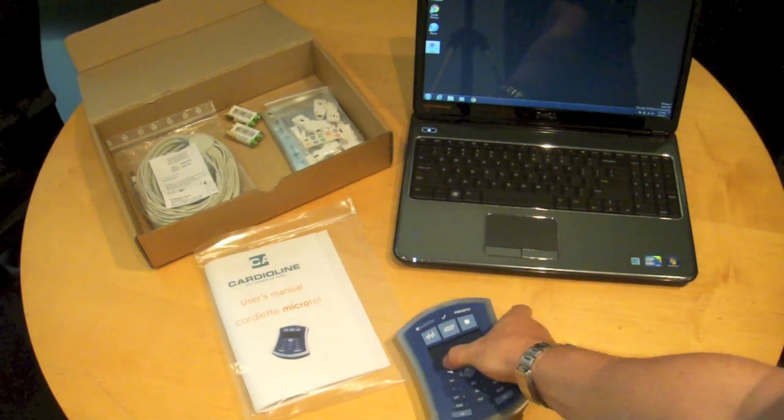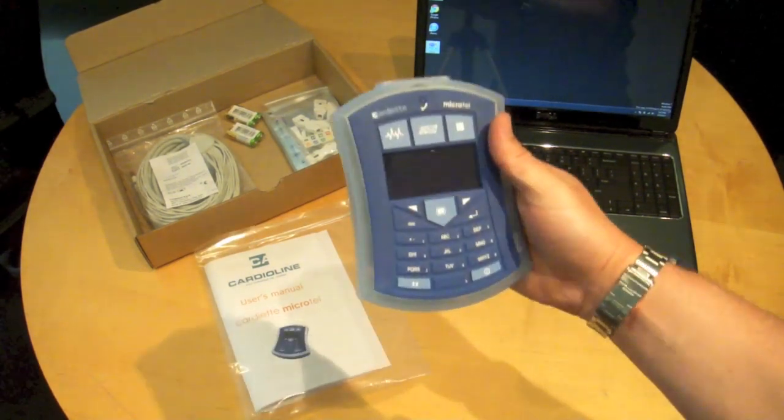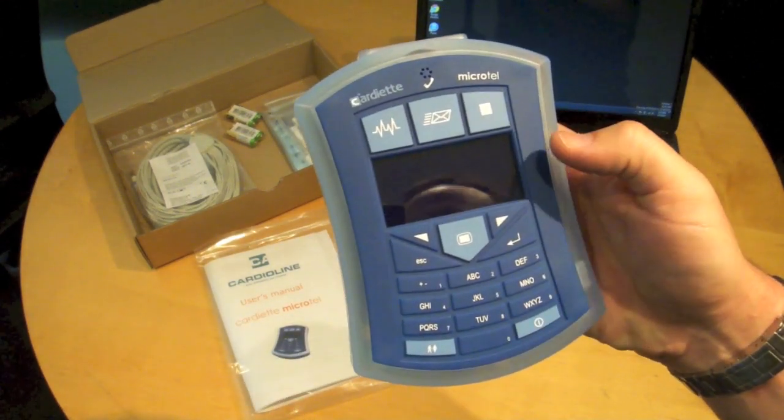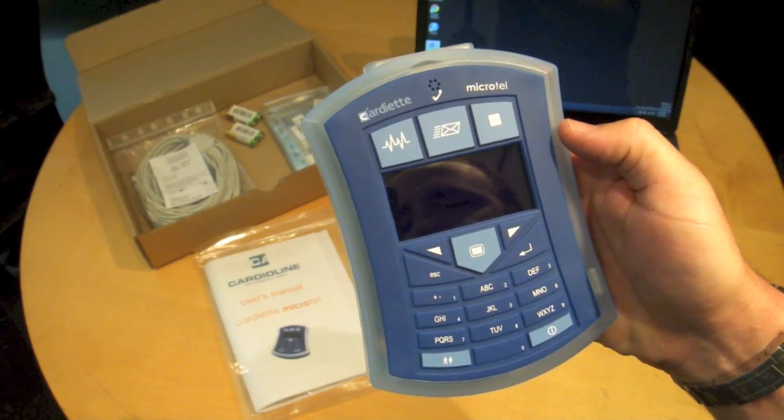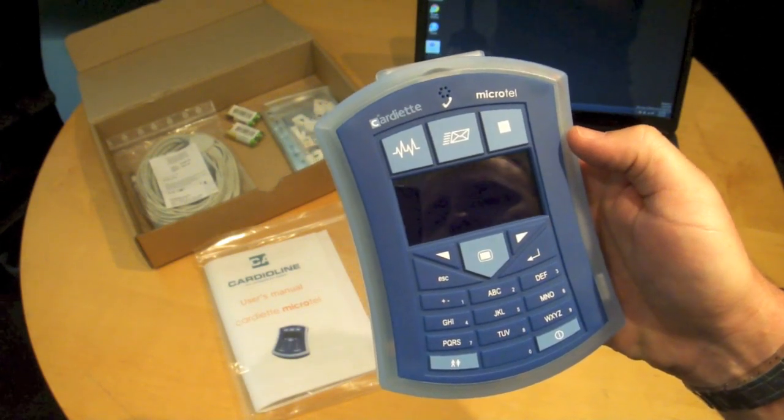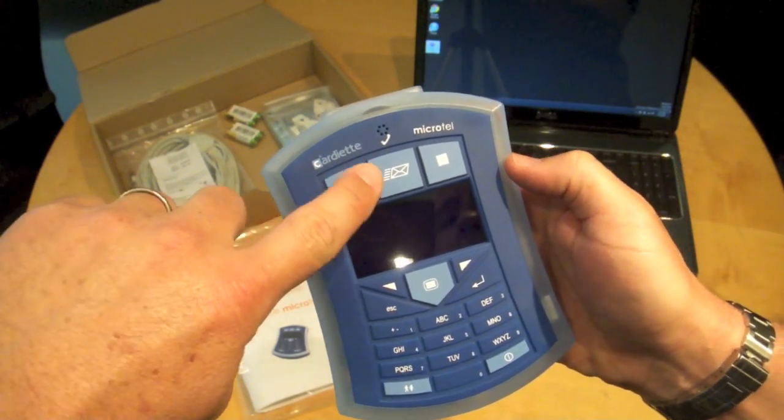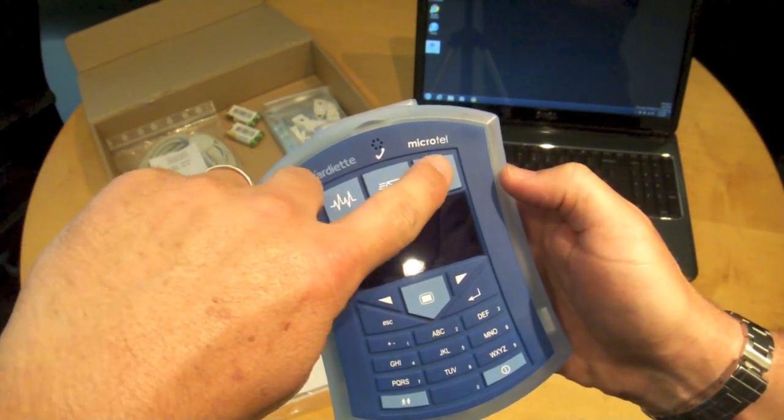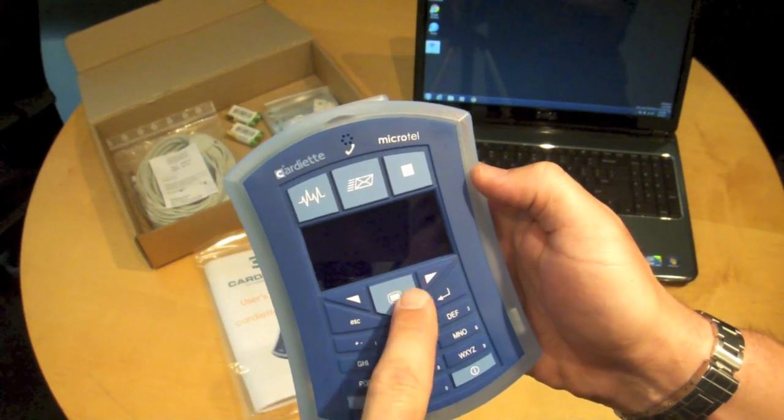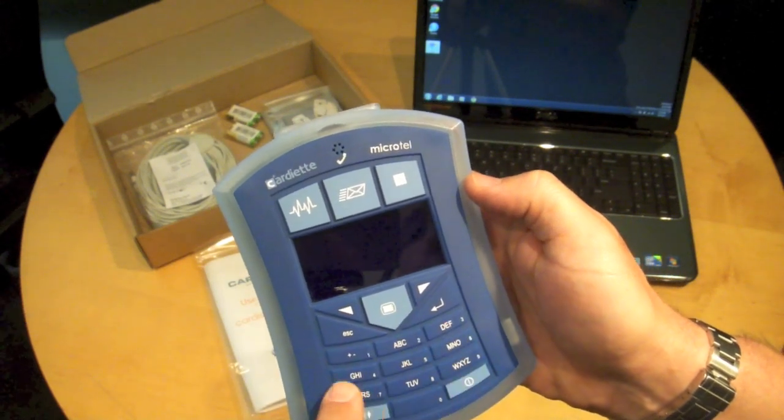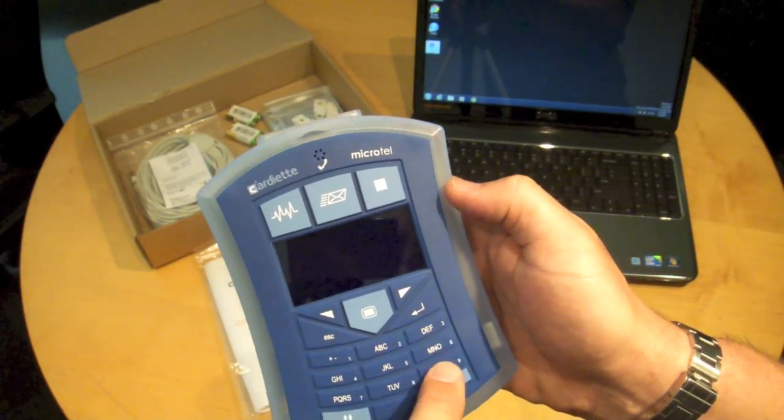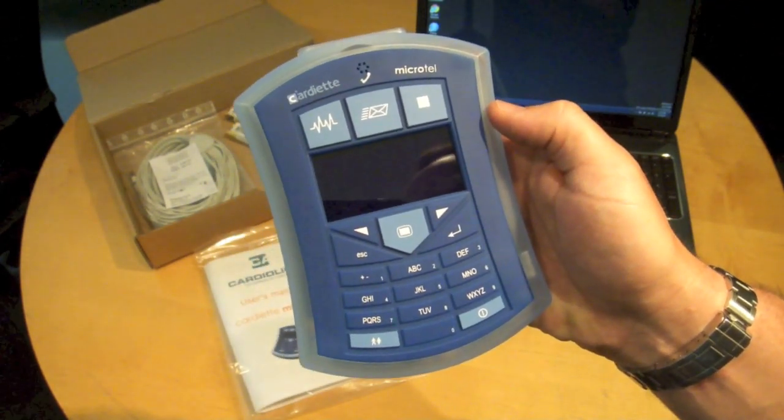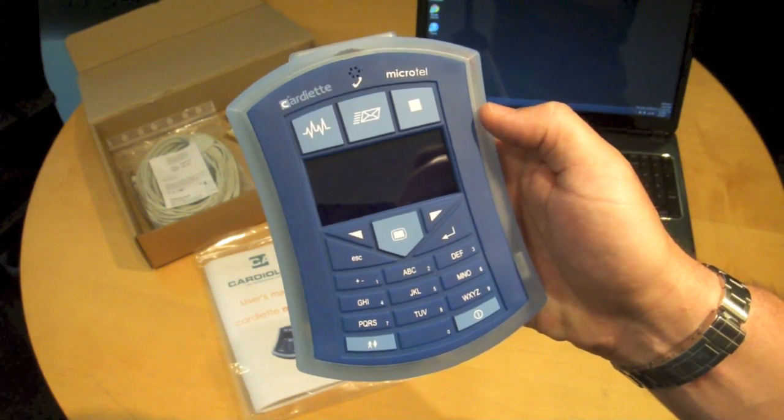You can see here the device is very compact. It does have a single lead preview screen, a start, send and stop button, the main menu button, a cell phone style keypad for entering patient data if you choose to on the device.